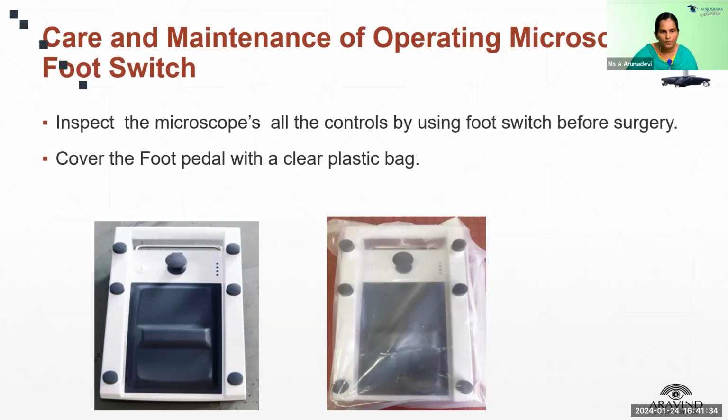Care and maintenance of the foot switch. Inspect all the functions of the foot switch before the surgery and wrap it using a plastic cover to protect it from saline spillage, without causing discomfort to the surgeon.